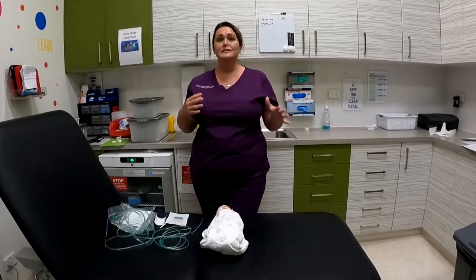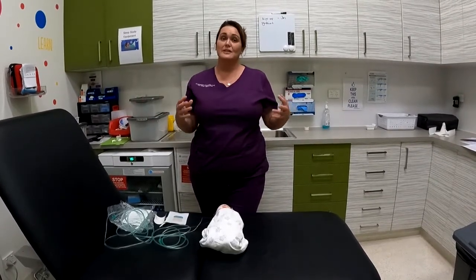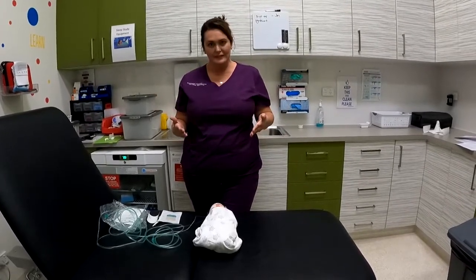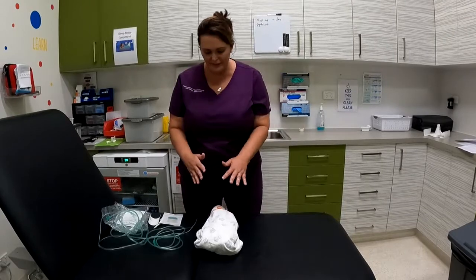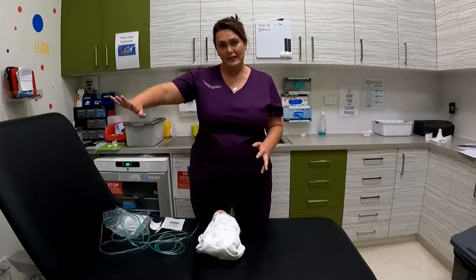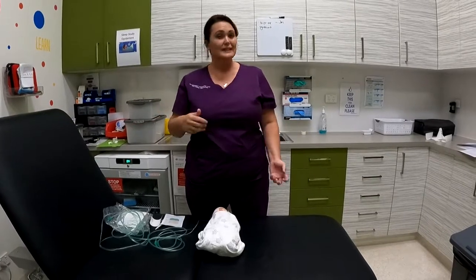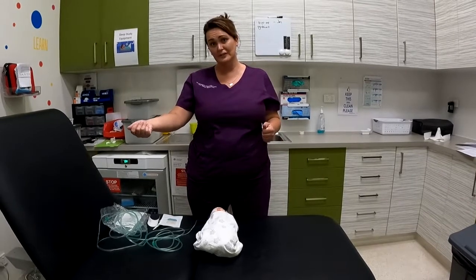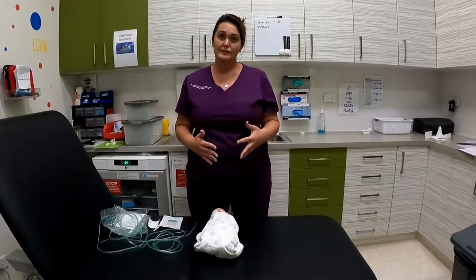You may have seen them do this, especially if you've had a journey through neonatal intensive care and special care. You might have seen them do this previously. So it's about recognising if anything's different and calling for help. If your baby was to ever have a colour change, so if they were to go dusky or blue, you'd want to quickly check all of your connections, and we'll go through that in a minute. Turn them up onto double their normal oxygen. So say if they're on 250 mils, you turn them up to 500 mils. And if they don't go back to their normal colour, you want to call an ambulance straight away.